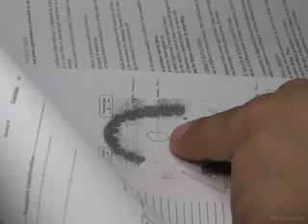Anterior posterior bar. Palatal strap. Palatal strap is in the middle. Anterior posterior palatal strap, okay, or anterior posterior palatal bar, okay. But what is the contraindication of a posterior component of the palatal? If the tori is larger than the vibrating line posteriorly, I cannot. Okay? So I'm left with the horseshoe design.